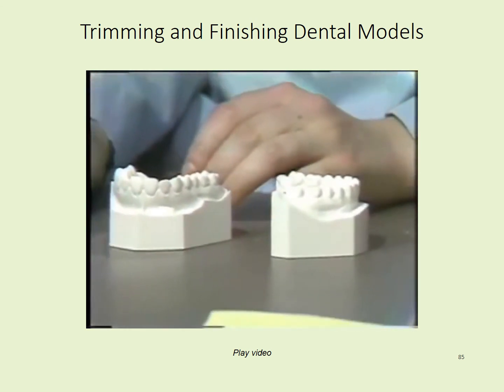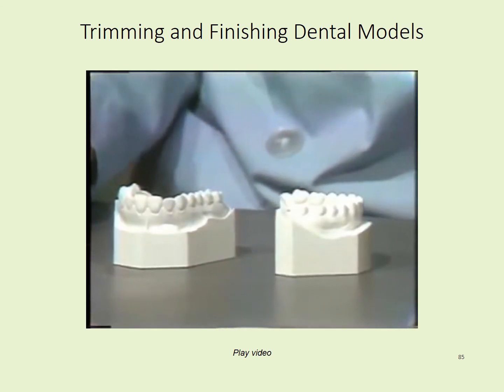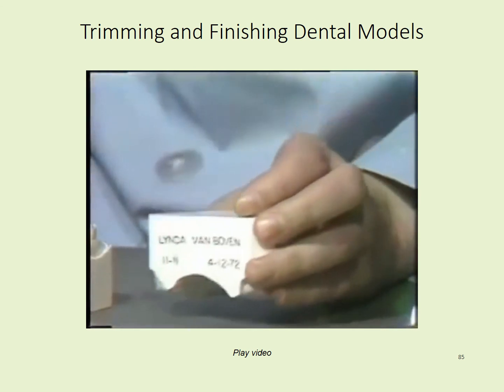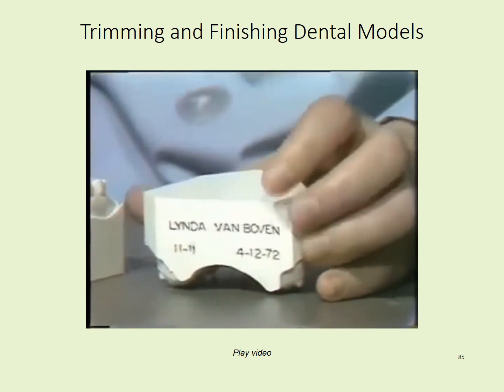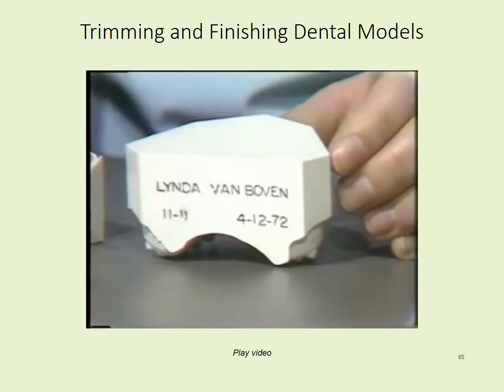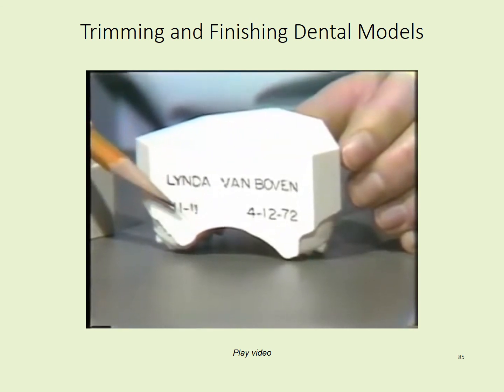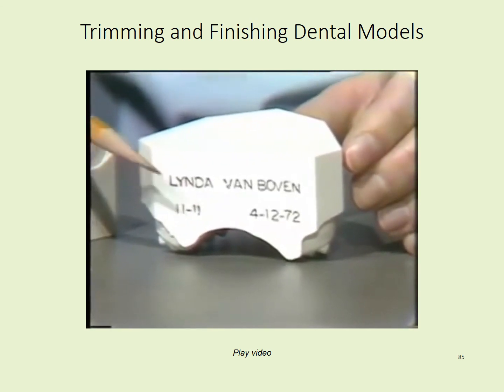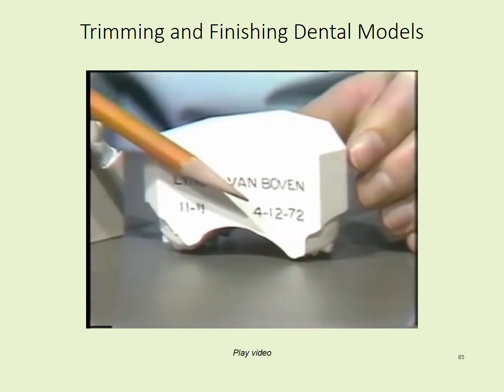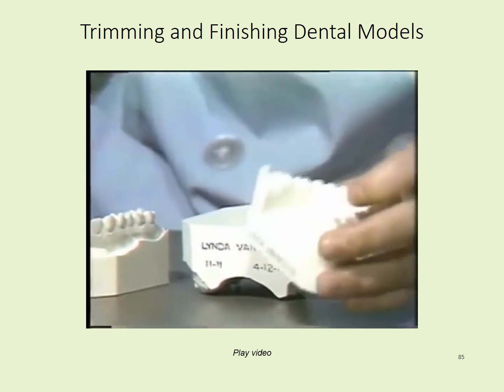Allow your models to dry for 1 to 2 days, and then label the models with a sharp pencil. You should print in capital letters 1/8 of an inch tall. On the first line, put your patient's name, and on the second line, the age in years and months, and the date that the impressions were taken. On the lower model, just put the patient's name.